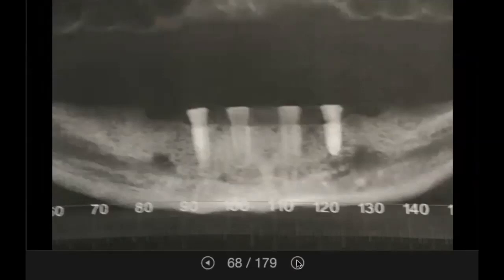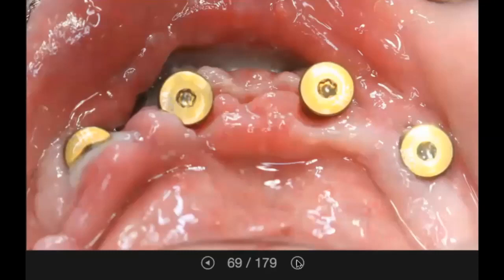The patient presents 2 weeks status post implant placement with a small wound dehiscence. Such wound dehiscences are common in the severely atrophic anterior mandible due to the pull of the mentalis muscle. The wound is treated with saltwater rinses and oral antibiotics should the site become secondarily infected.